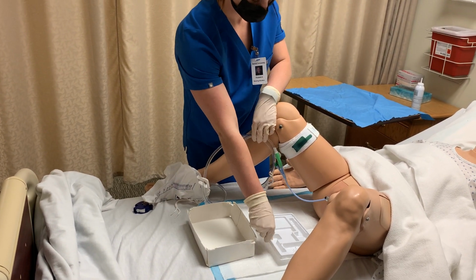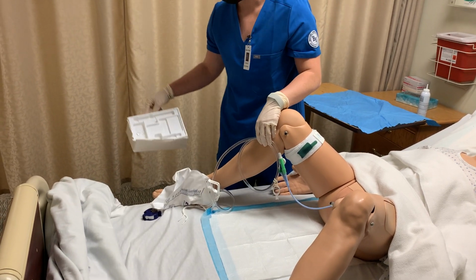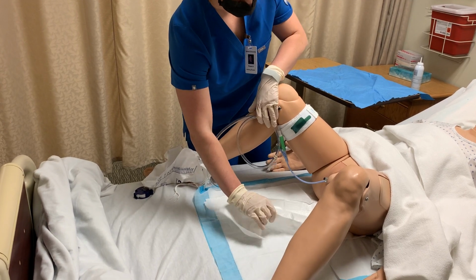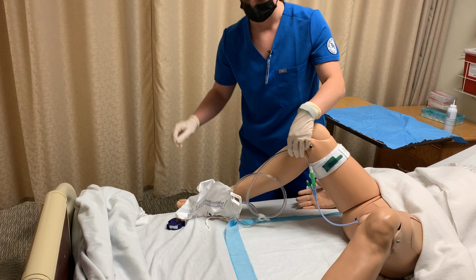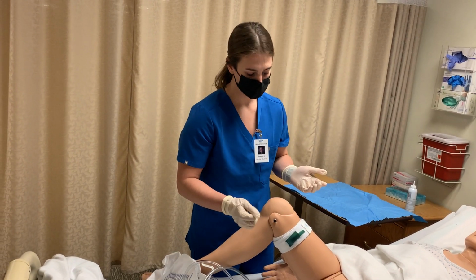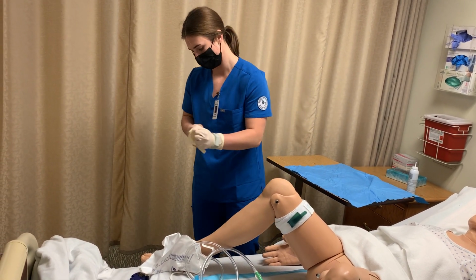Okay. We are going to remove our supplies. And discard. And we would perform pericare at this time if we needed to, just to clean up the area. And I'm going to remove my gloves.